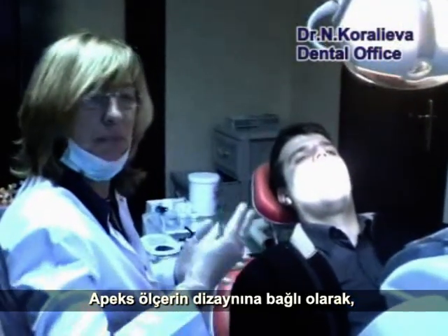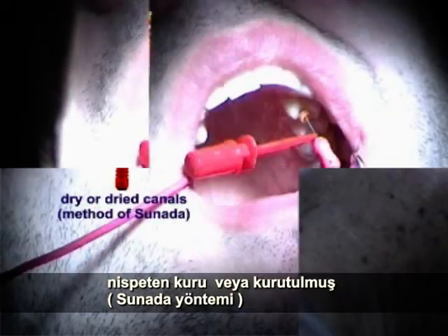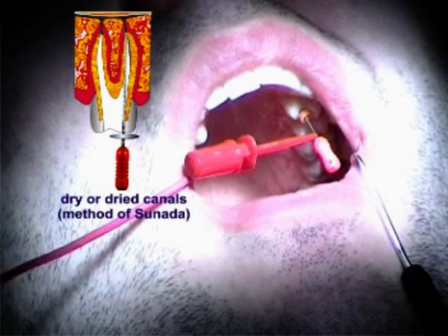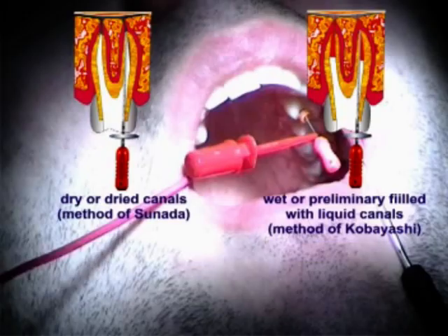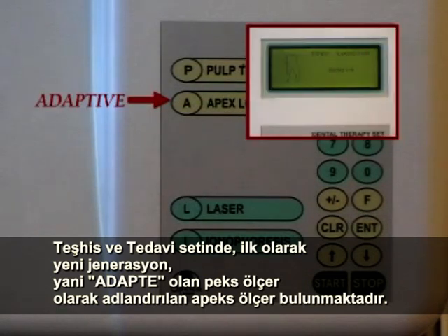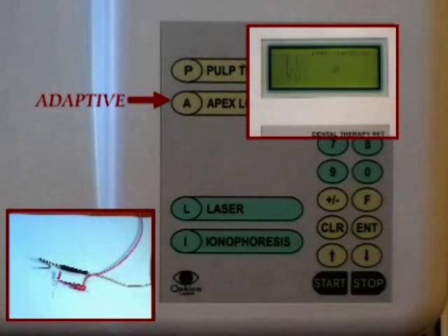Depending on the design, Apex locators can work well in a relatively dry or dried canal, method of Sunada, or in wet or beforehand liquid-filled canals, method of Kobayashi. For the first time, in the diagnostics therapy complex Scorpion, there is a new generation Apex locator, the so-called Adaptive Apex Locator.